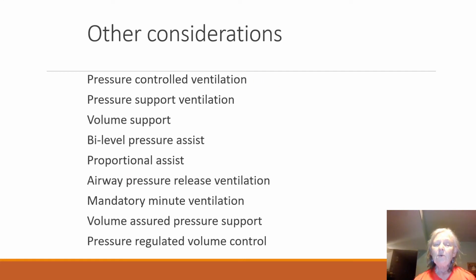So other considerations, what do we have? Pressure control, pressure support, volume support, bi-level pressure assist, proportional assist. There's your APRV, airway pressure release ventilation, that we're starting to see used quite a bit out in the community. Mandatory minute ventilation, I'm sure we still have that.